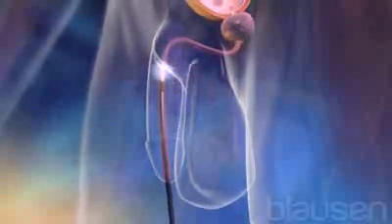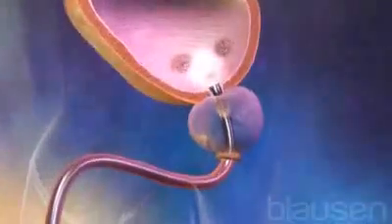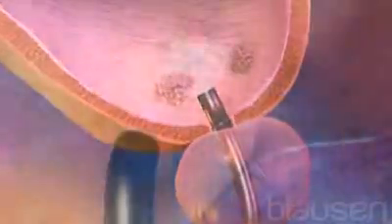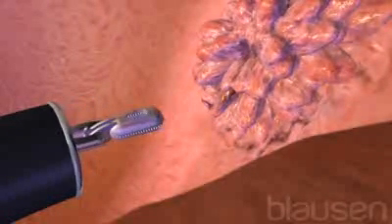During endoscopy, a tube with a lighted camera is inserted inside the body and can be moved around to obtain different views of organs and tissue. Forceps and brushes that remove tissue samples can also be guided through the tube to obtain a specimen.